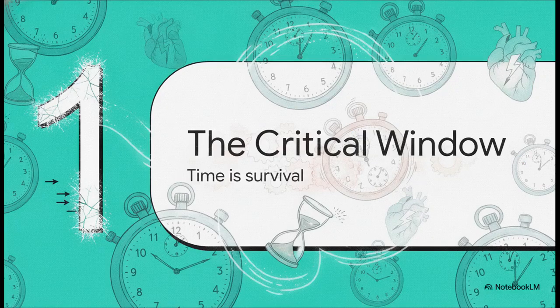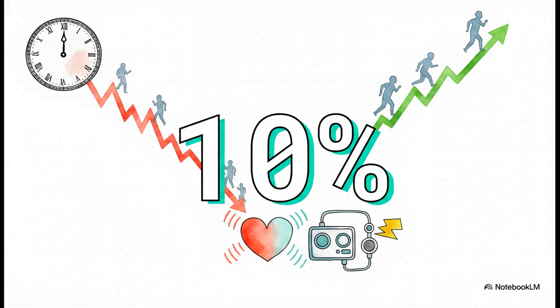Section 1. The critical survival window. We're going to start with exactly why time is your absolute biggest enemy in a sudden cardiac emergency. 10%. Think about that number for a second. For every single minute that passes without an AED shock, a person's chance of survival drops by approximately 10%. Literally, if 10 minutes go by, that window of survival essentially closes tight. This makes immediate action absolutely critical.